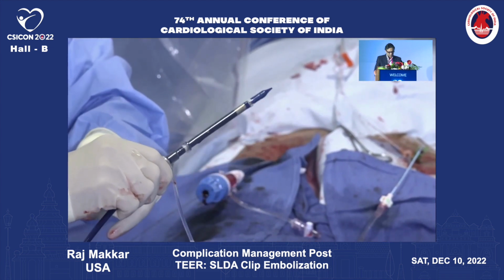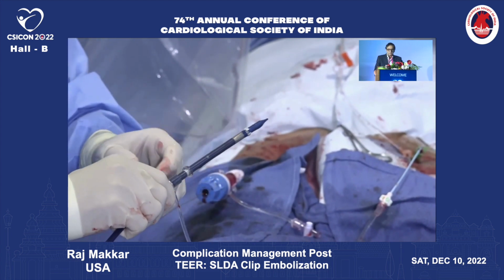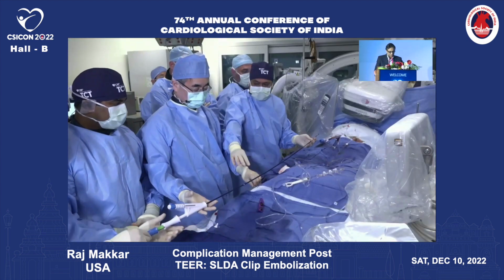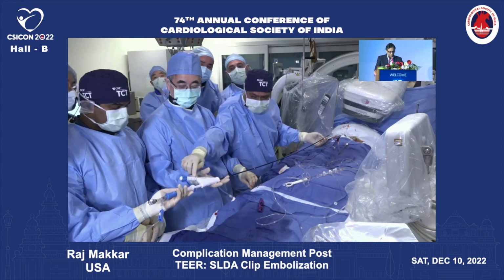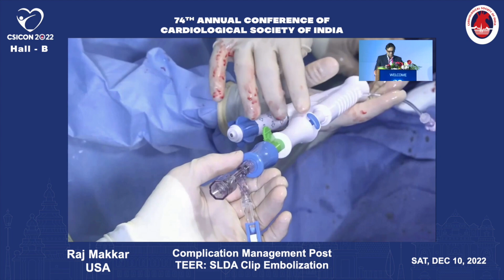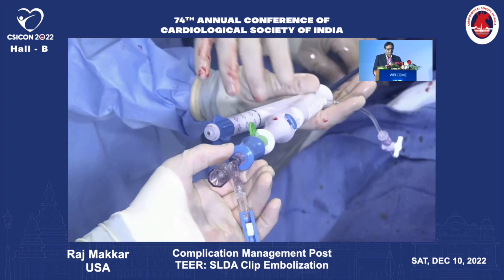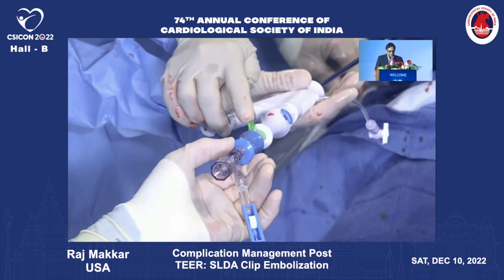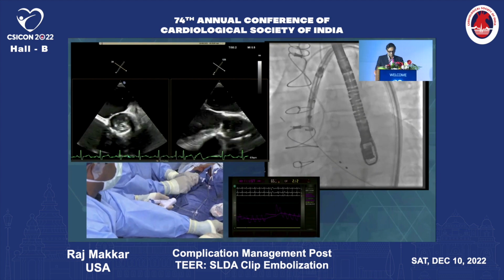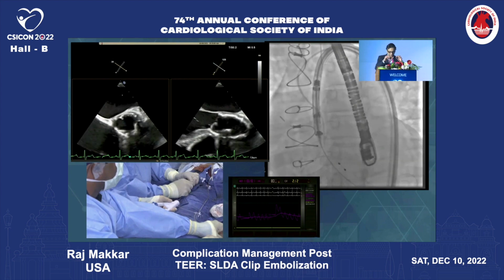I'm going to hold this thing together here and make sure that as we are introducing this, these are not damaged. Of course, this is the delivery catheter, and this is the deflector. This is the controller, which gives us the ability to go forward and backward, and the ability to rotate the valve. This is a safety lock, which is ahead of this release button. So we want to go ahead and align the markers.